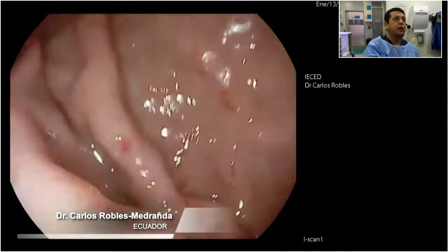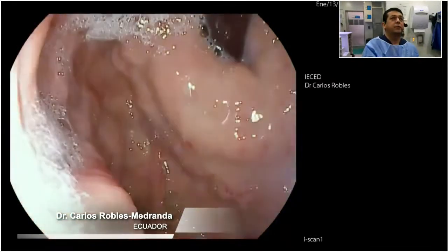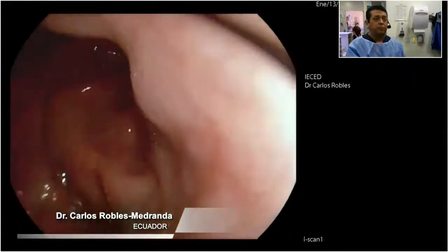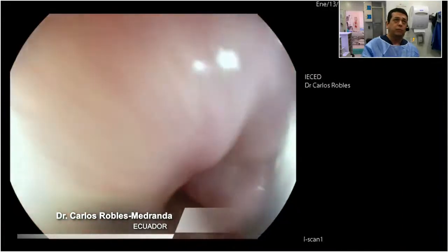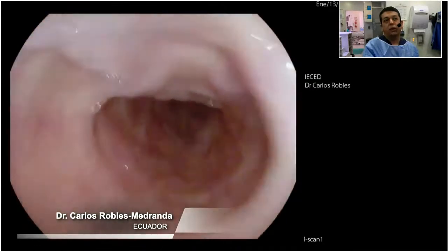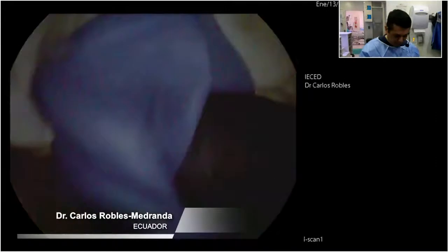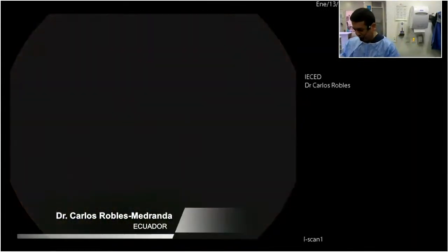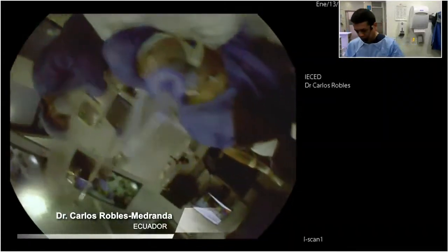This patient doesn't have gastric varices. It's very important to evaluate that. So this is good. The proposal today is to do a band ligation using this new kit. So I want to try this new band ligation. I want to say hello to my good friend Chris Lee. Chris, I will try for the first time this band ligation. Thank you for the support.